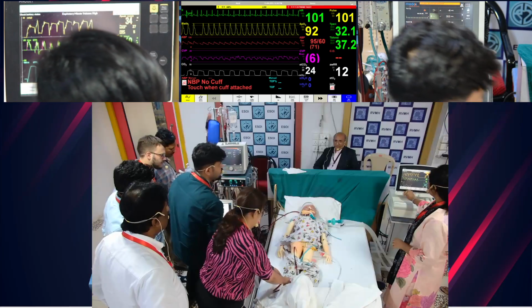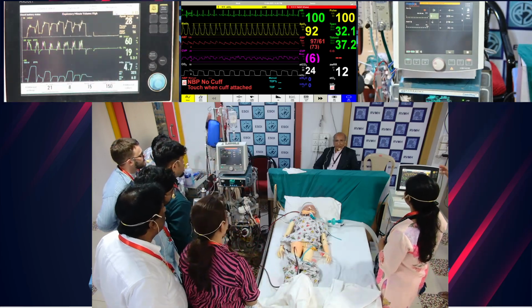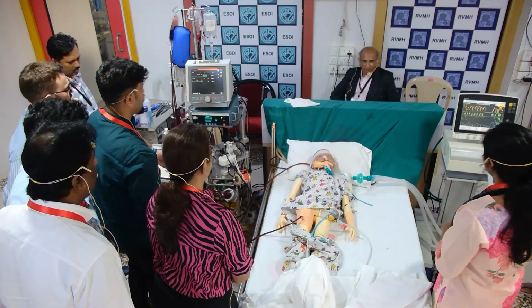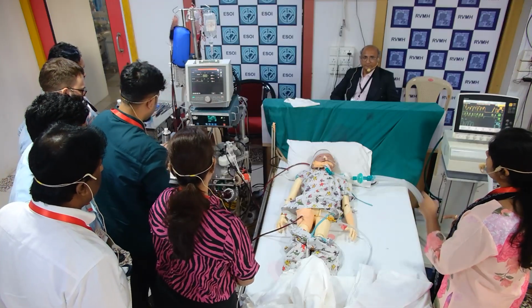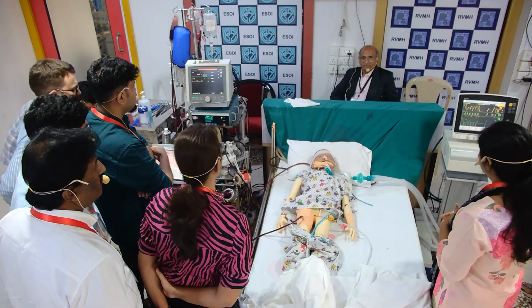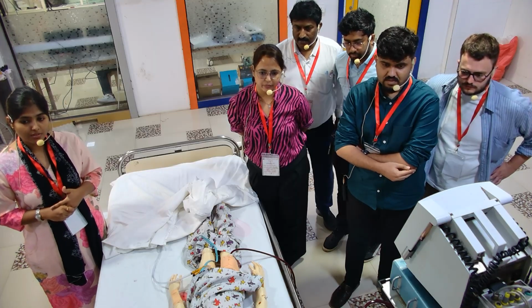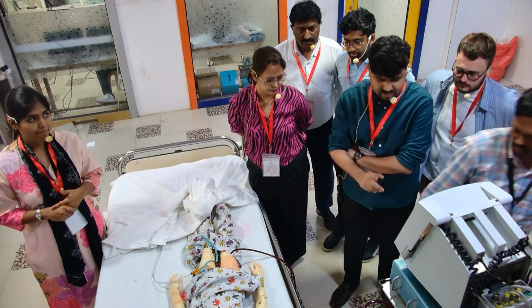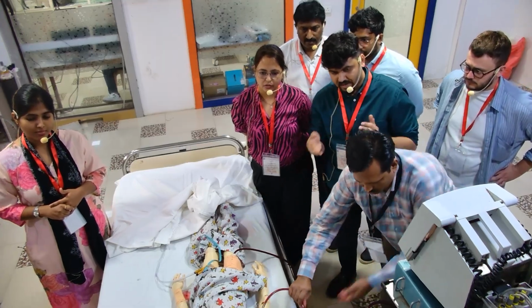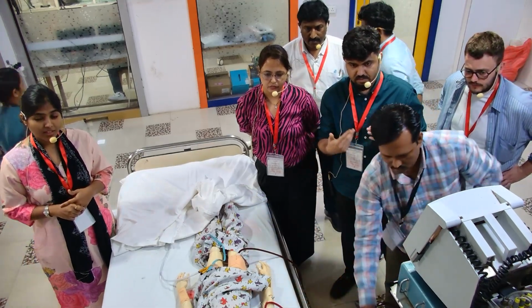Okay, so that ends your scenario. What was your scenario? Kinking of the cannula line. How will you diagnose that? Because of the sudden fall in flows, the pressures decrease. Initially there was an increase, then there was a fall in the flow, sir. Despite corrective measures, the flows were still not improving by either reducing or increasing the pump speed.